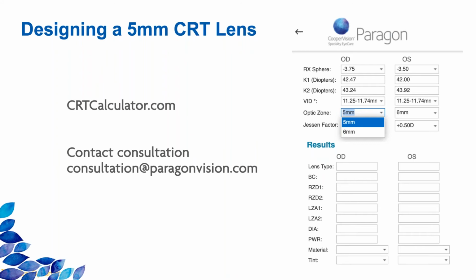You now also have the opportunity to customize Jessen factor, and that will show you the results of the lens design recommended. If you are ordering this lens either through consultation or your account manager, just a reminder that you will want to specify that it is a 5mm optic zone diameter lens.